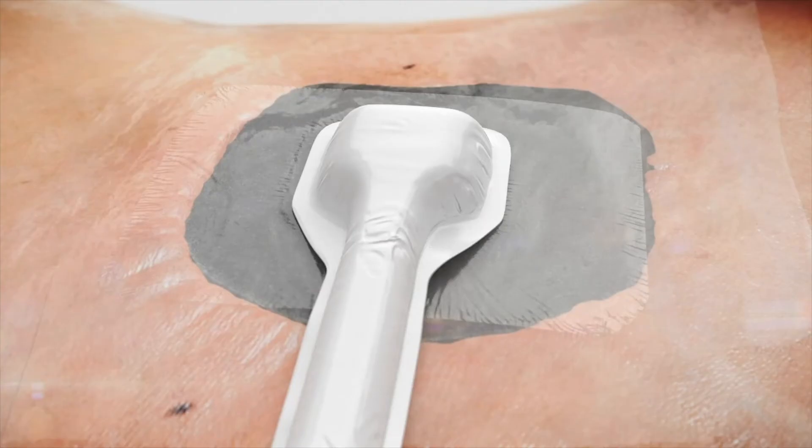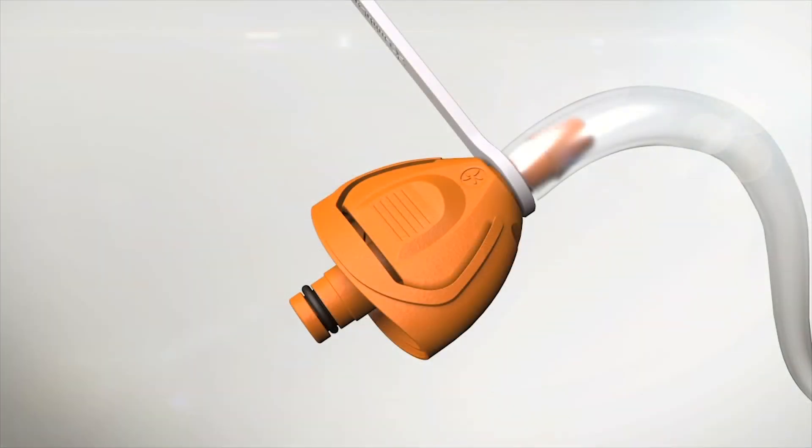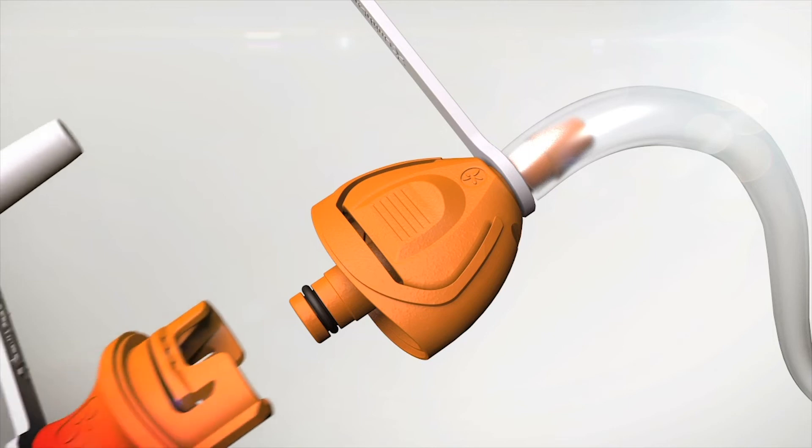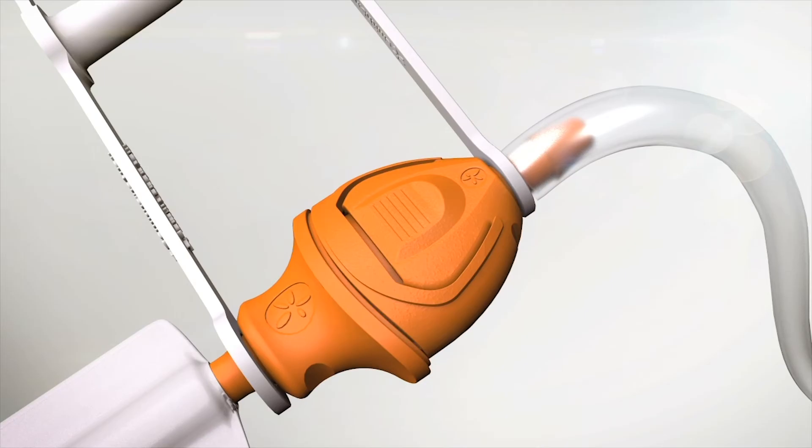Secure the Renesys soft port to the patient according to your local protocol. Ensure the aeration disk located near the quick-click connector is not covered or otherwise occluded by the method used to secure the soft port. Connect the Renesys soft port tubing to the canister tubing by pushing the quick-click connectors together — an audible click indicates the connection is secure.